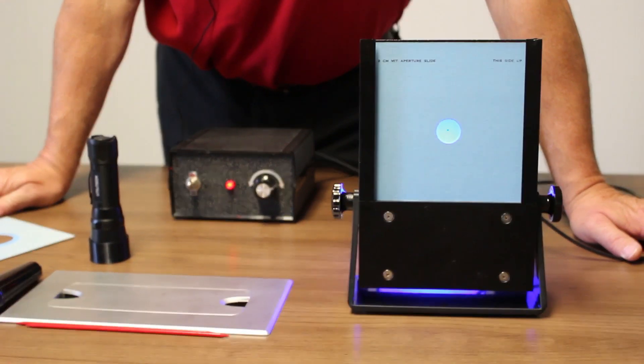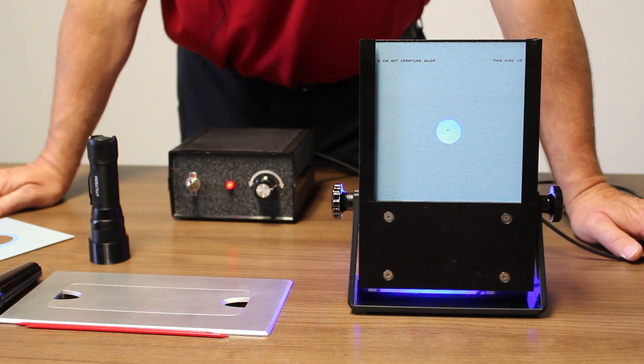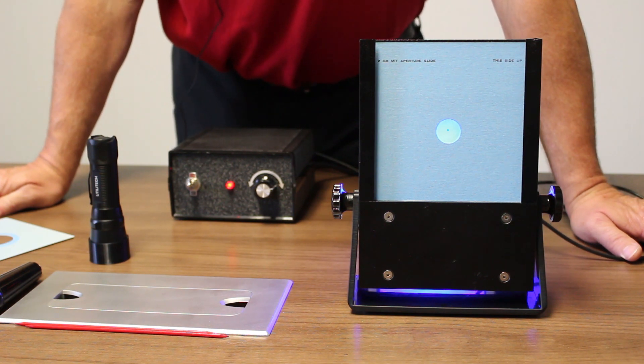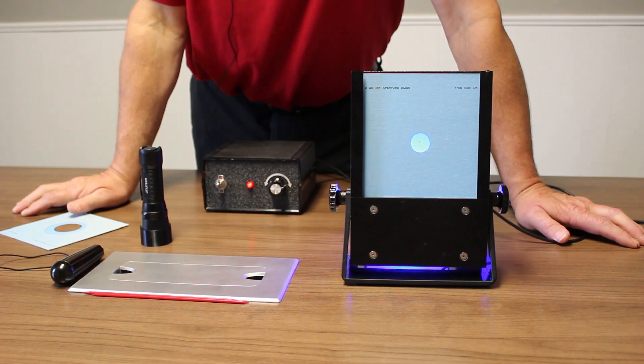If they have eccentric fixation, they'll be looking at the dot with the eccentric point, but the propeller or the Hadinger brush will be spinning around the fovea. Therefore, it will be offset or won't be spinning around that dot. You need to know in what direction the propeller is from the dot and how far away that is.